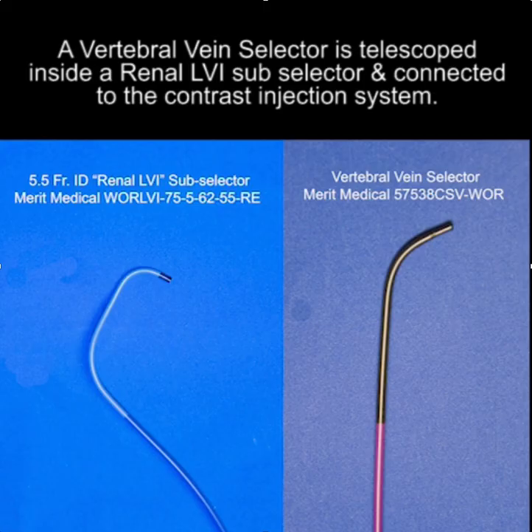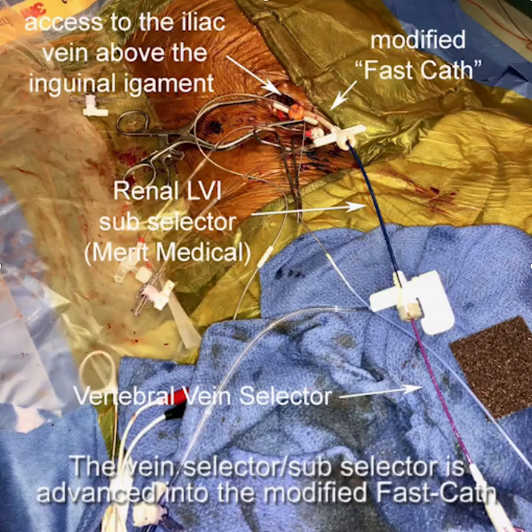To get the lead in place, we utilized the combination of a vertebral vein selector telescoped inside a renal LVI subselector, connected to the contrast injection system. That's what we have here.